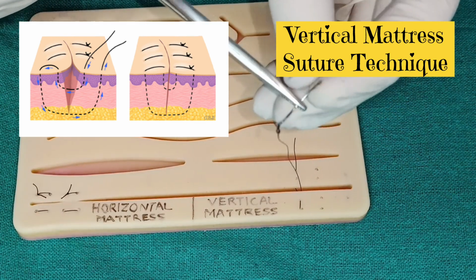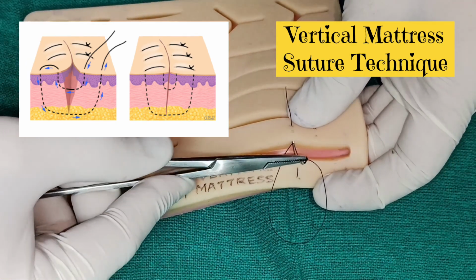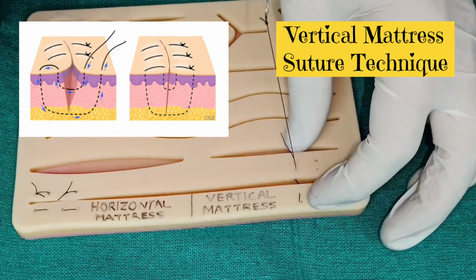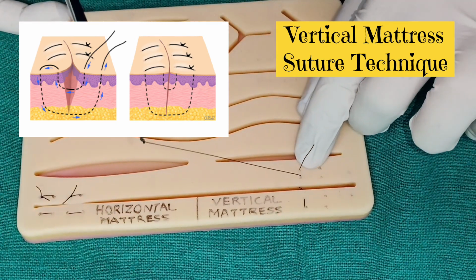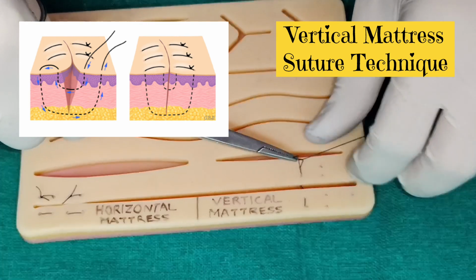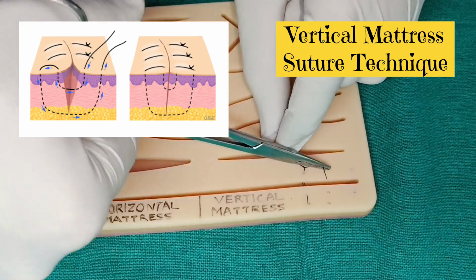Depth of the bite is more in the far loop as compared to the near loop. After passing the needle through both loops, we will tie the suture to achieve proper wound approximation and tissue eversion.